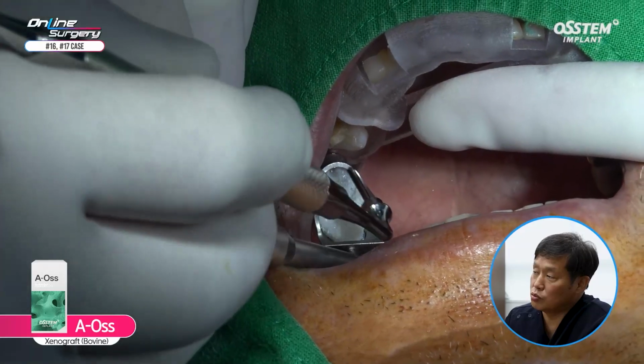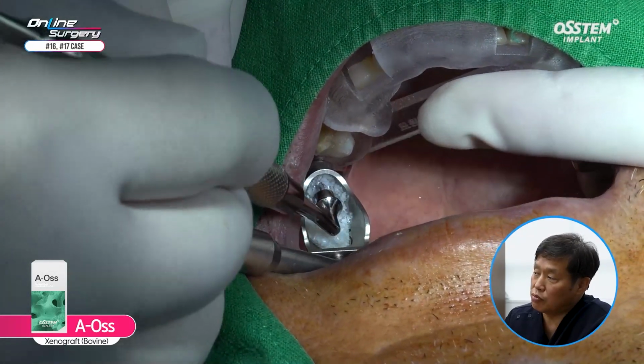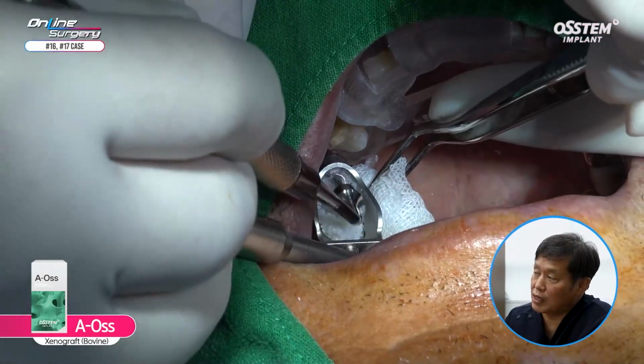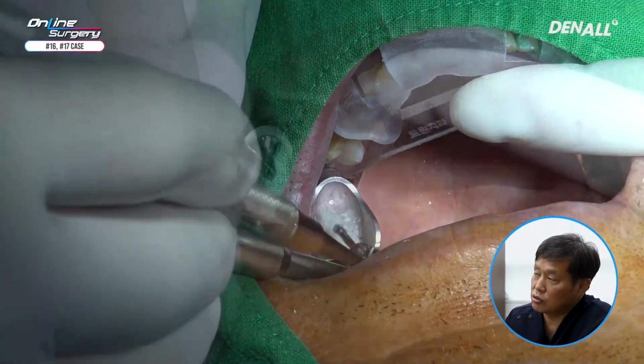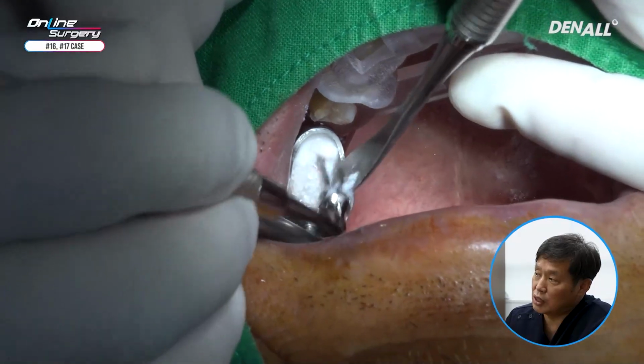Condenser is used to place the bone graft materials in slowly. If you put in an excessive amount, it can be blocked. You need to move forward gradually.